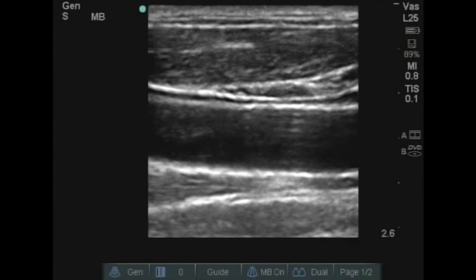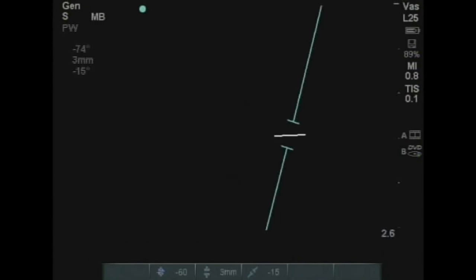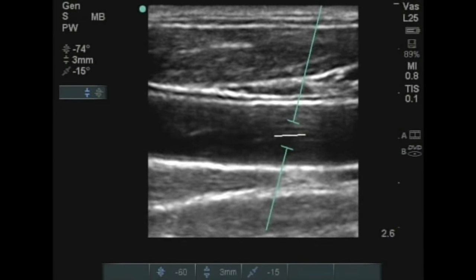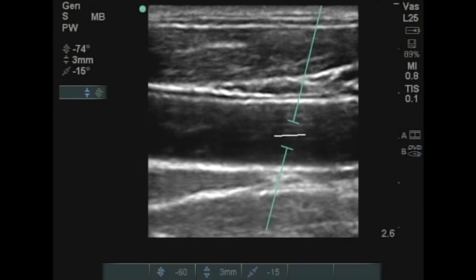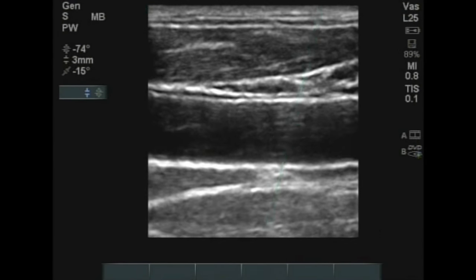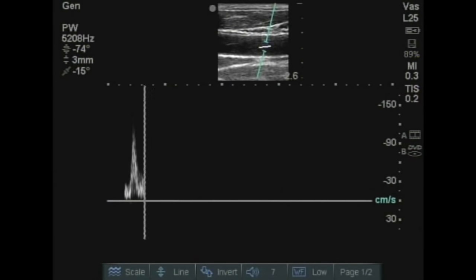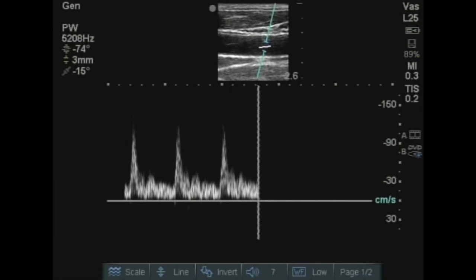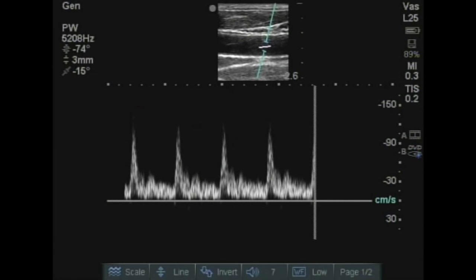In spectral Doppler, a grayscale image is obtained and the Doppler gate is placed within the vessel. Any reflectors traveling through that gate between the two green bars are mapped out on a graphical scale.